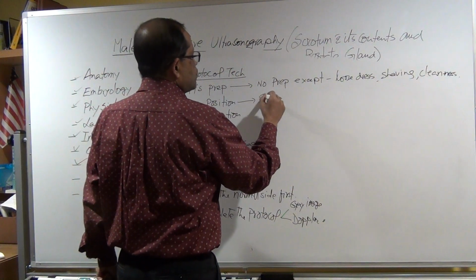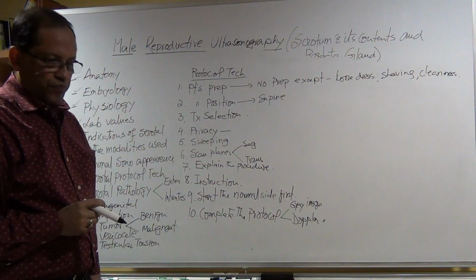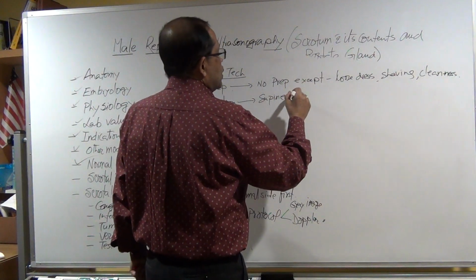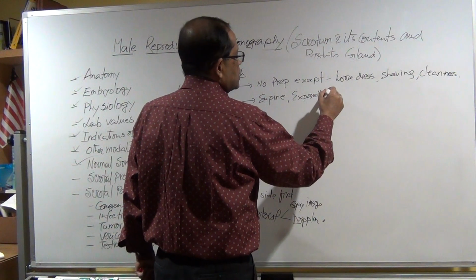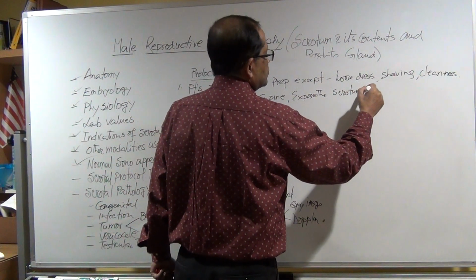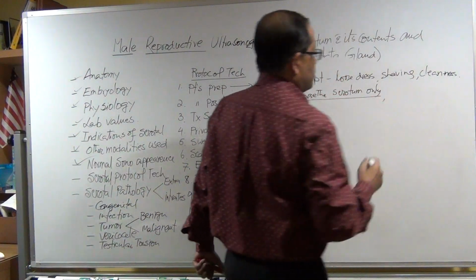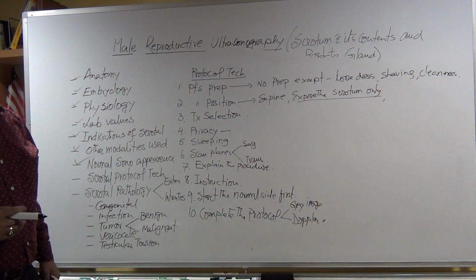Position: supine. In the supine position you have to be careful to expose the scrotum only. That means the penis will be covered by a separate piece of cloth.